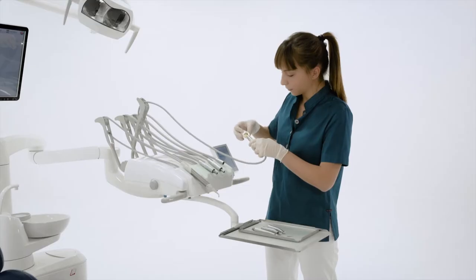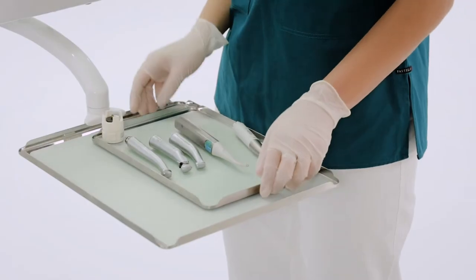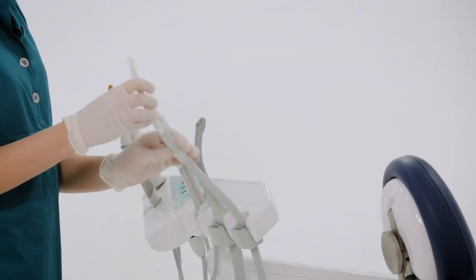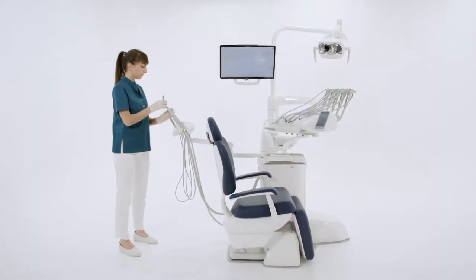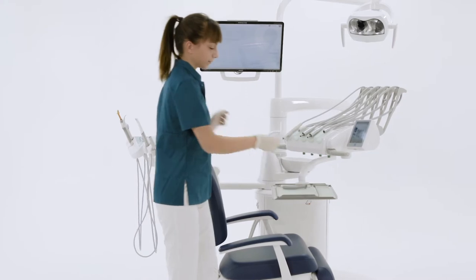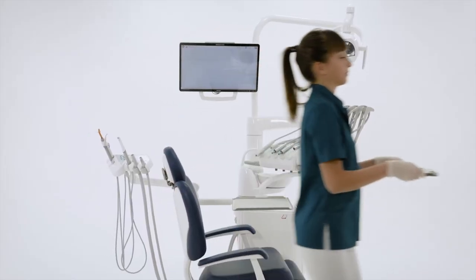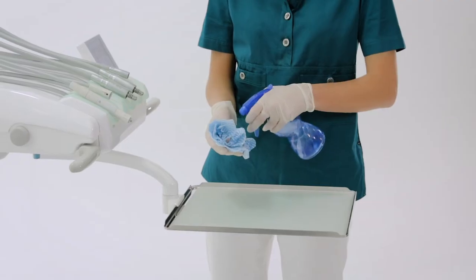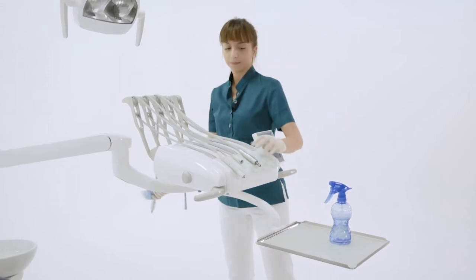The assistant removes the dynamic instruments without their tips and burrs, and the cannula ends, and takes them to the sterilization area. The assistant then cleans and disinfects the exposed surfaces of the dental unit.